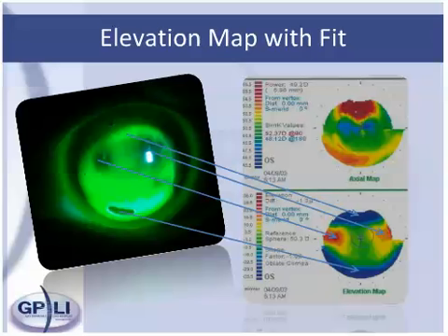That means centrally the cornea is flat or not changing much, and both superiorly and inferiorly the cornea is changing a great deal. When you look at the contact lens on this cornea, you will note that there is touch centrally and bubbles inferiorly and superiorly. The elevation map shows high areas centrally. These high areas correspond to the areas of touch underneath the contact lens. The elevation map also shows low areas in the superior and inferior regions, and this corresponds to the areas that the bubbles are seen on the contact lens fit.